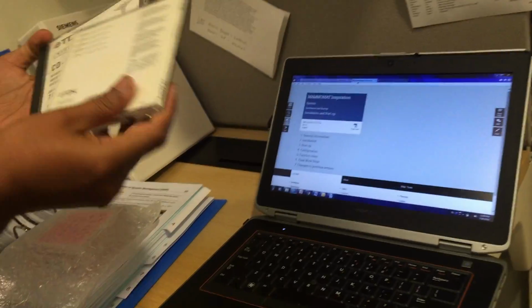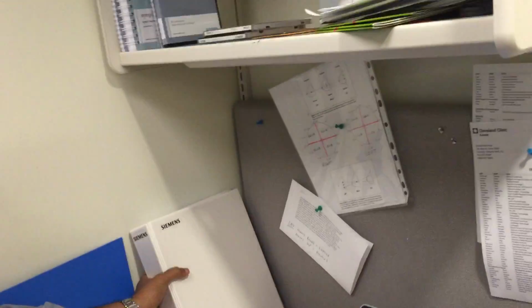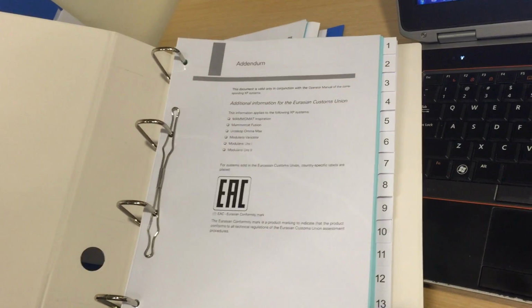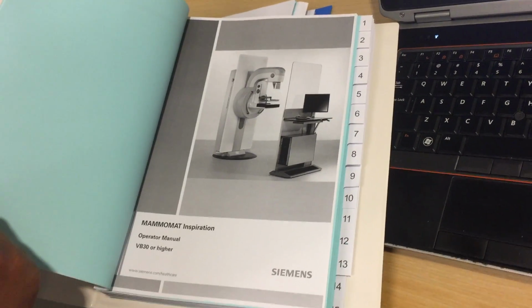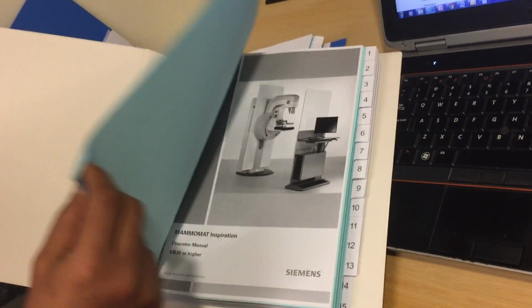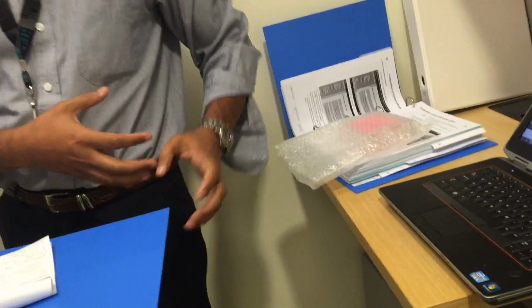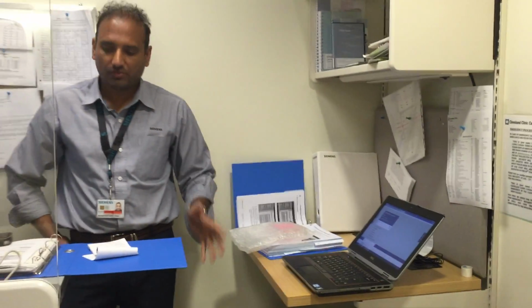You asked about the reference manuals. There should be a CD for that, a soft copy. Oh, this is the operator manual that I'm asking about. Okay, the operator manual, how to operate the buttons or knobs, how to use the machine. Yes, that's right, they can consult it. Perfect, so now we've covered a lot. Those books stay in the room, and if not, it depends on the customer, but everybody knows where it is.